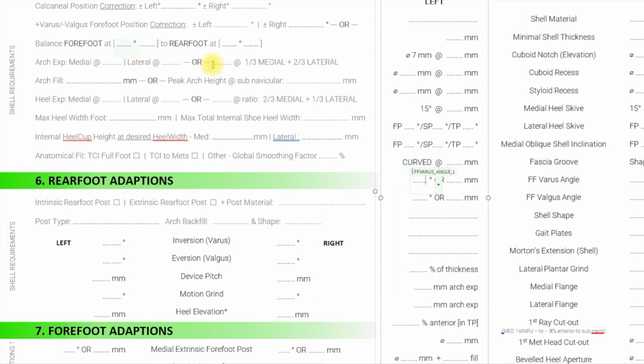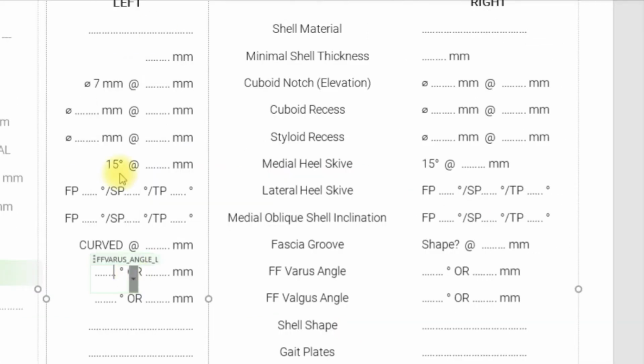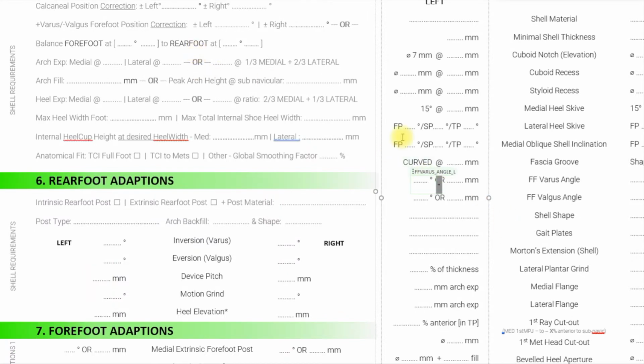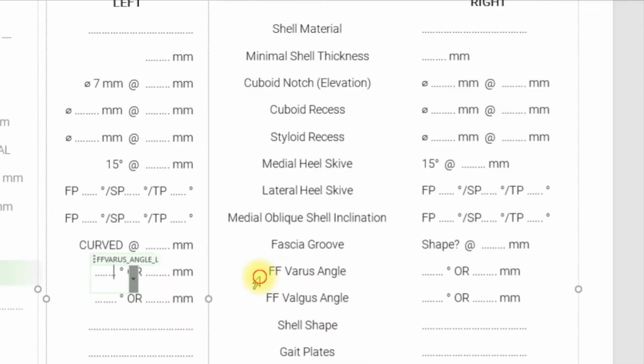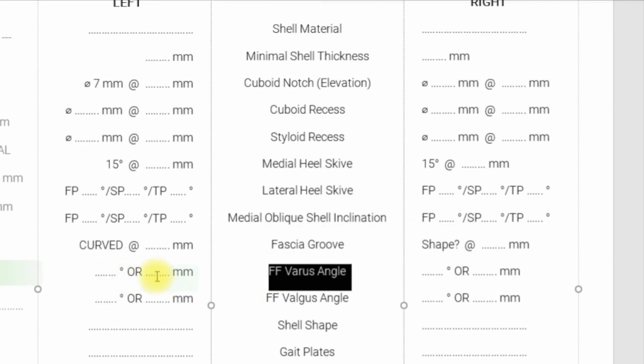So this is commonly where people will get confused, but you are able to have the ultimate power to change what it is that you want to see in the foot at any given point. Back and forth, you can do the two same things at different points here. So forefoot Varus angle, you can tell us at a degree that you want the forefoot at the rear foot.